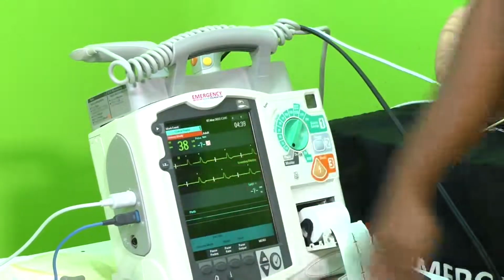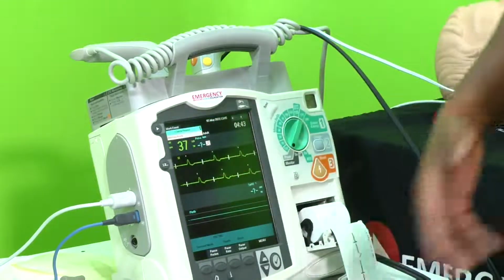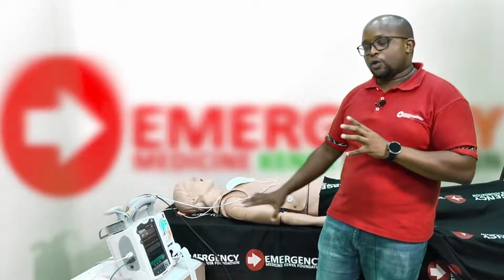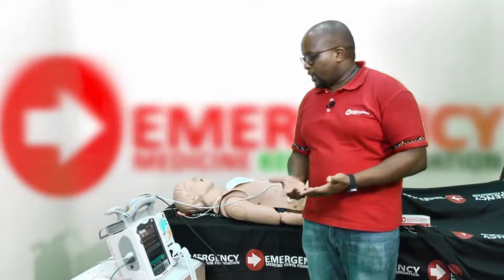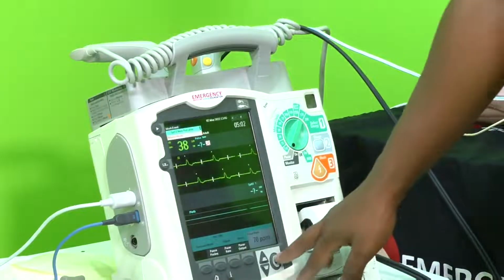I can see my pacing spikes. Now I'm going to determine what rate. My patient's heart rate is 38. 38 is too low. Remember in terms of perfusion, you need good heart rate and good stroke volume. I know my patient is not hypovolemic for any reason, but the heart rate is a bit low. So I'm going to start at a rate that's comfortable and more or less what we normally are used to. So I'll press the pacer rate and we'll start at 70 beats per minute.